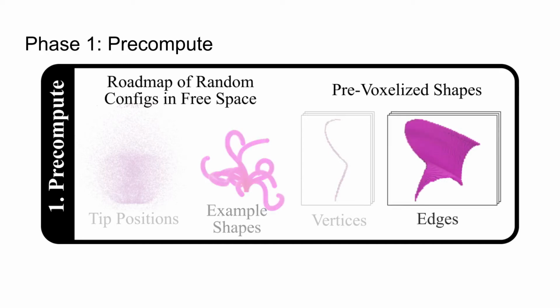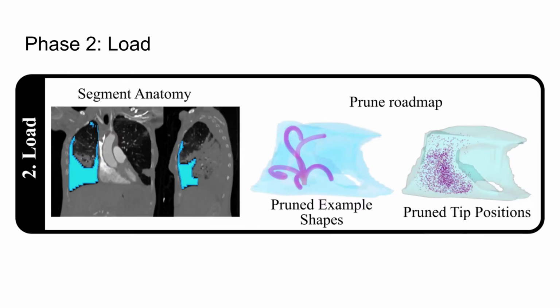For the edges connecting configurations on the graph, we precompute the voxelized swept volume of the motion between connecting configurations. Roadmap precomputation is done without knowledge of the anatomical environment and only needs to be done once per robot design. In the load phase, we load the anatomical environment and precomputed roadmap and prune away in-collision vertices and edges.